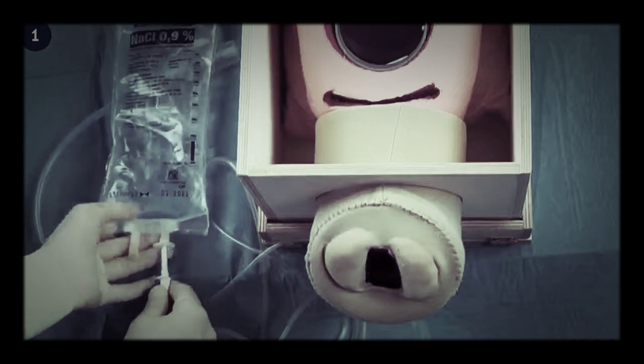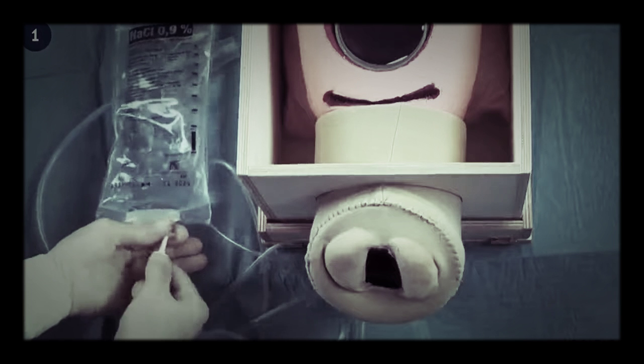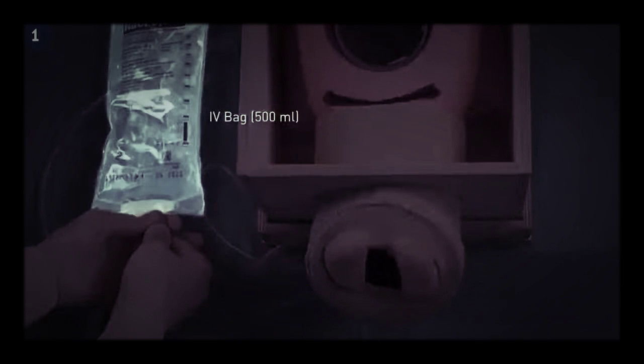To prevent overinflation of the balloon, it is advised to use a volume no greater than 500 milliliters.